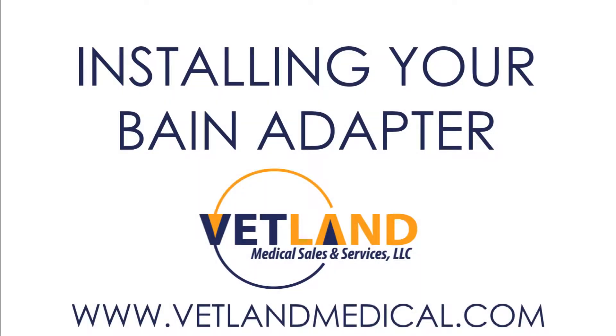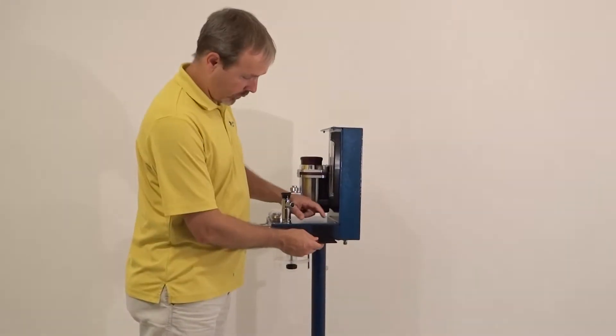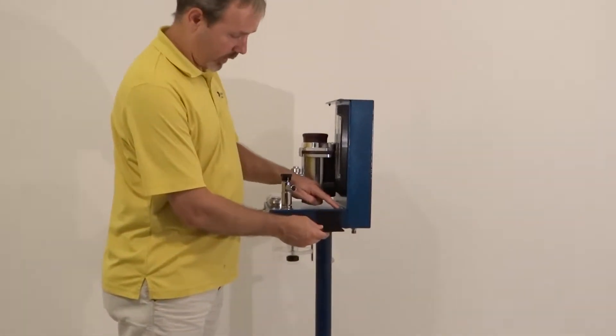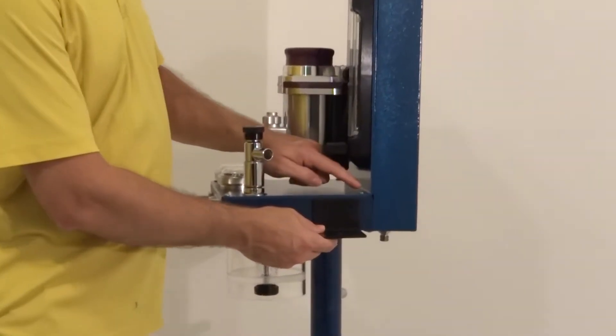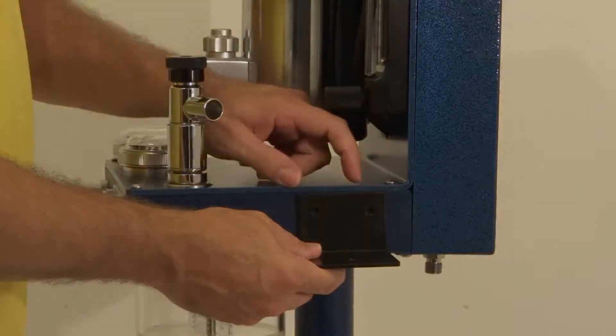Installing your Bain Adapter. You'll install the Bain Adapter using the provided metal bracket. Make note to avoid the screw on the top of the machine's block panel.